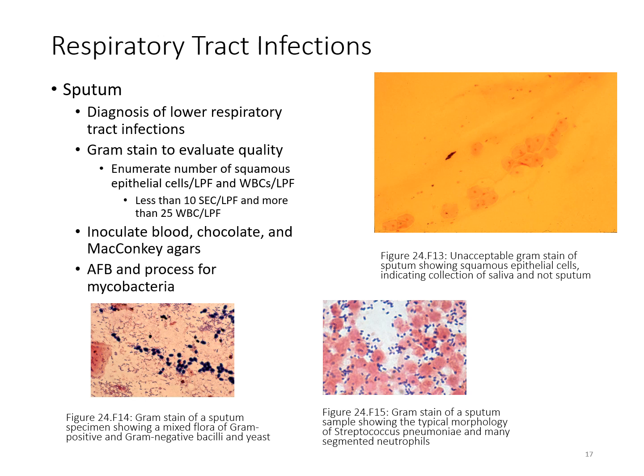So the sputum is going to be coughed up and induced, and that sputum itself is going to be put into a container. However, sometimes patients will cough and can't really get that productive sputum up, so they'll just spit, and they can contaminate it with more spit than actual sputum sample.